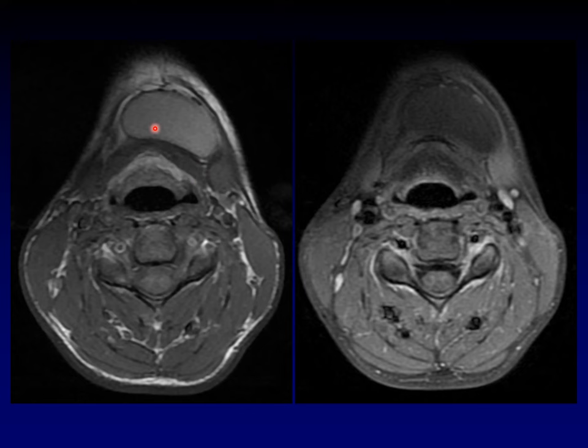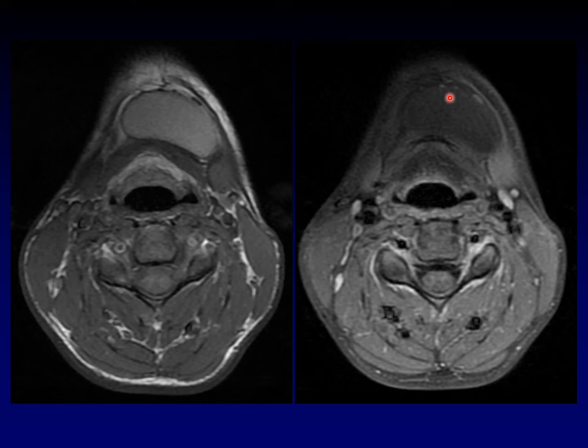Another important clue is that when we apply fat saturation on our post-contrast imaging, it saturates. The mass is at least partially filled with fat. A thyroglossal duct cyst can become bright on T1 weighted imaging due to recurrent infections, but that won't saturate out. Saturation on fat images indicates fat content.